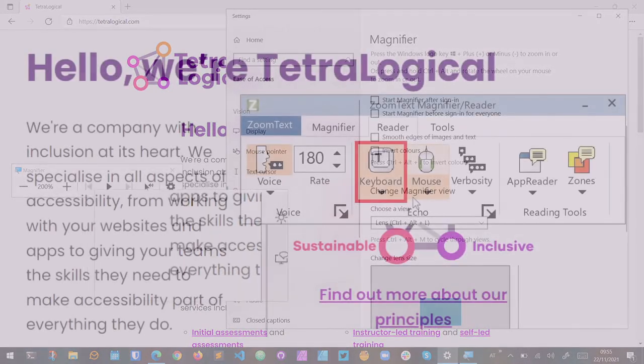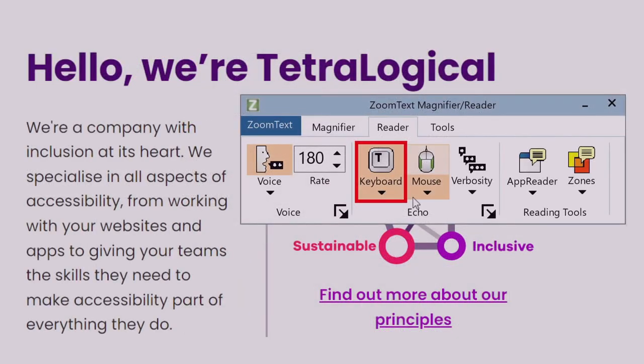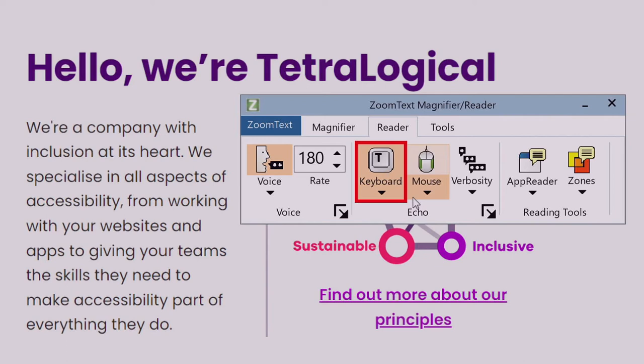Many screen magnification solutions also include speech output or integrated screen reading capabilities. Taking ZoomText as an example, you can enable mouse echo, which will read out any text underneath the mouse pointer.